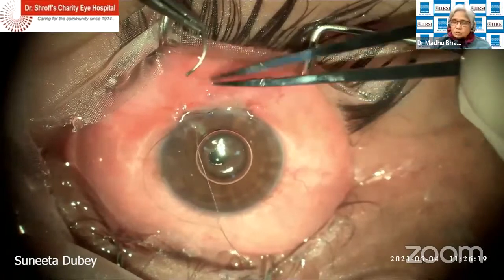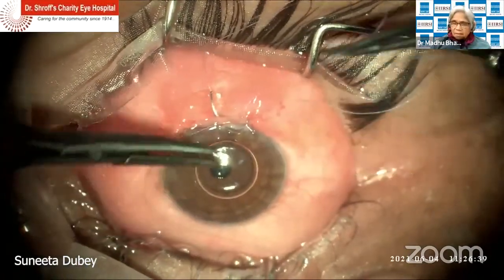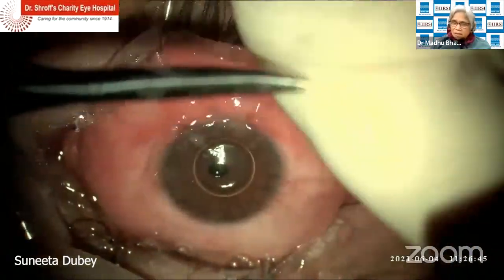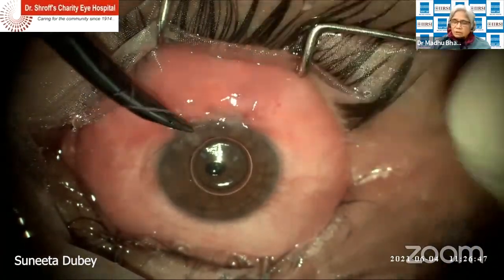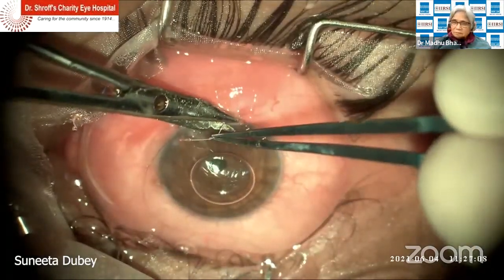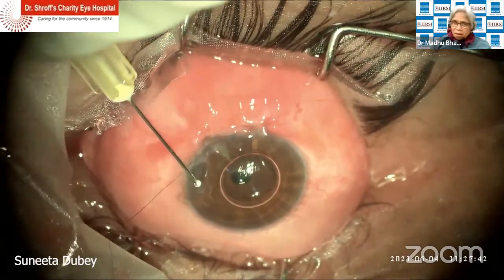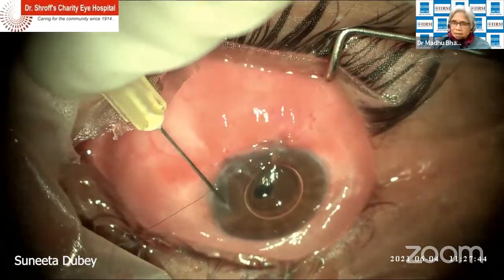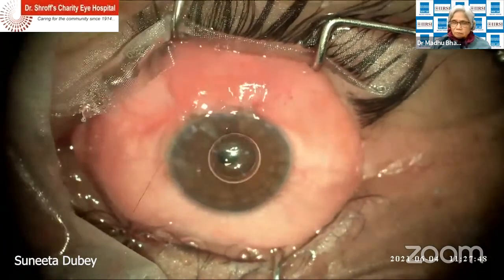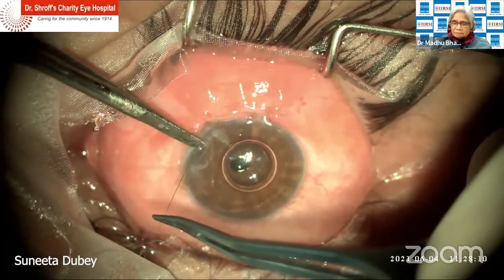And the AC on its own should remain very nicely formed. These two things have to go simultaneously. Many a time the AC on the table just is not forming, and we really think we need to put three sutures, especially in people who are very young, where the scleral rigidity is very high. So a well-formed AC and a slight ooze from the wound is desirable. For that, you may require any number of sutures. Number of sutures is not a criterion.